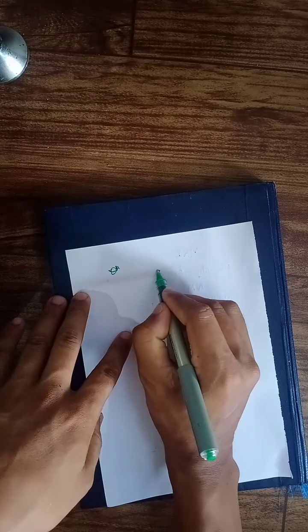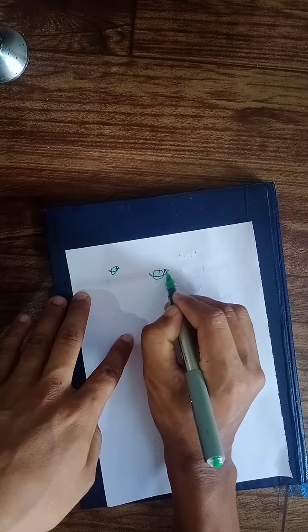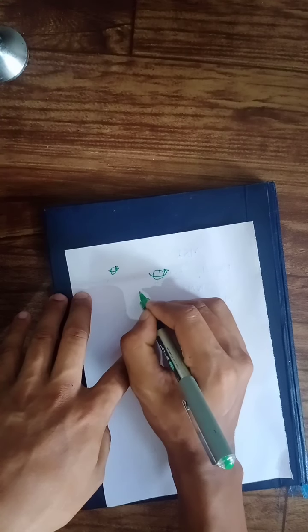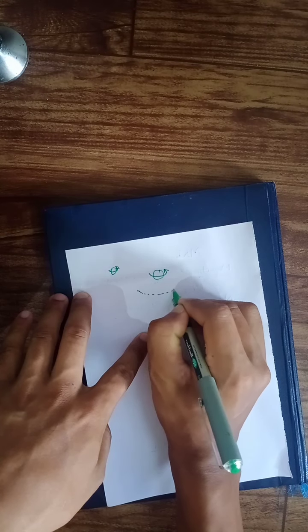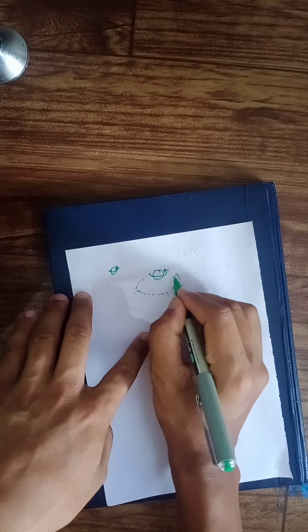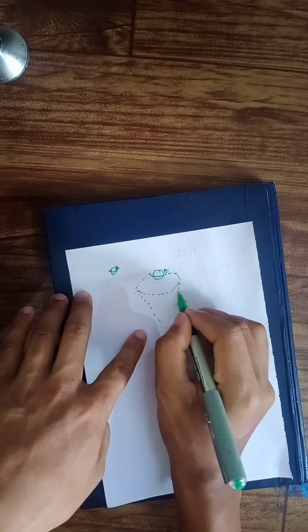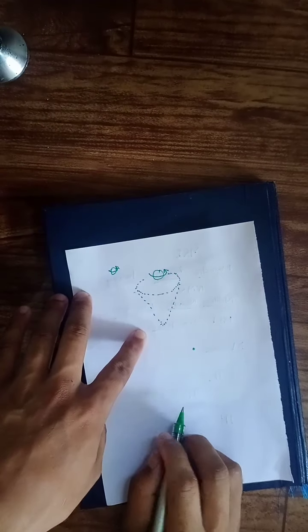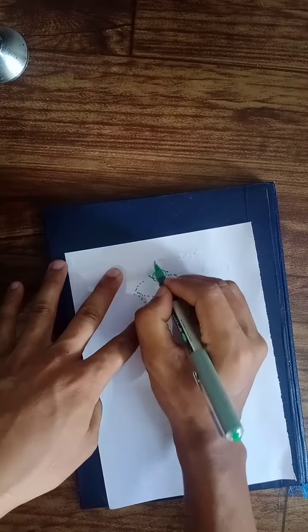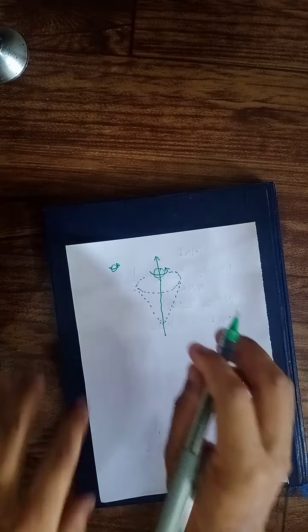But why am I discussing this? Suppose this is a proton, and I'm drawing this arrow showing that it's spinning. Imagine it precessing, so it gives the shape of a cone like this. Obviously in the middle there will be the axis. So it spins as well as precesses. But why are we discussing this? Let me clarify your doubt now.